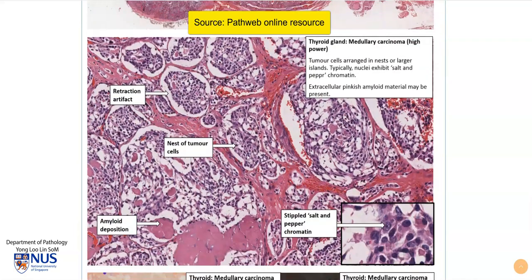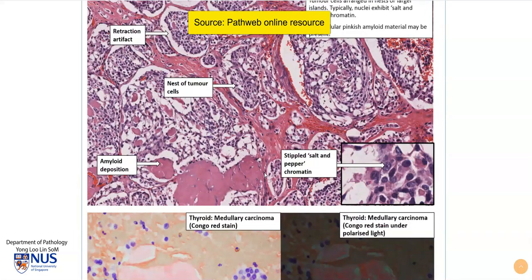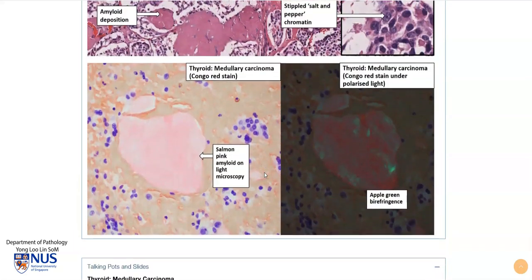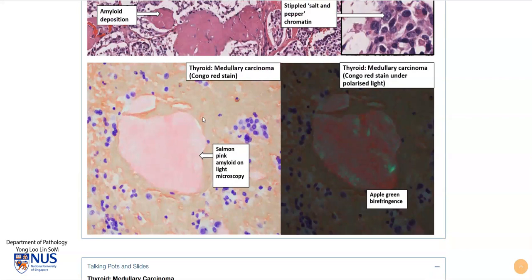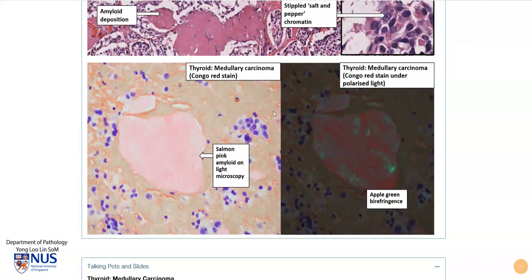Moving on, this is the Congo red stain in an area where there is amyloid. On light microscopy there is a salmon pink kind of color — quite pretty — but if we polarize this and look at it under polarized light microscopy we'll see the very classical apple green birefringence, and this is what Congo red looks like when amyloid is present.